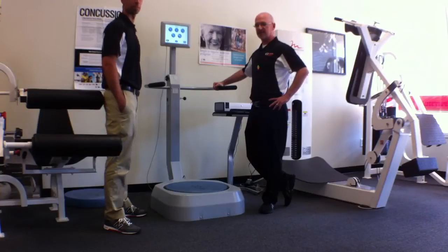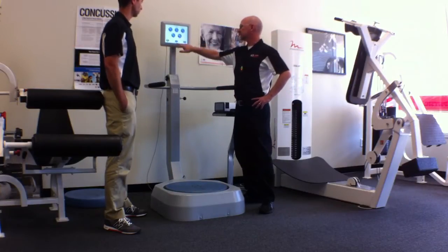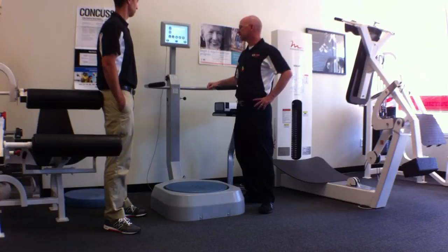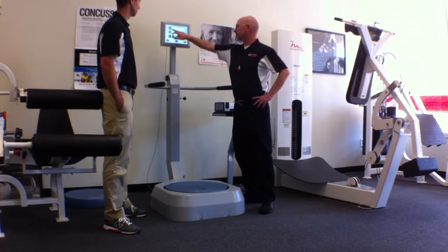Biodex has put together a test for us, but I want to make sure we're all on the same page for that. On the base screen, we're going to choose testing, and then fall risk is right up there. We can just hit fall risk. In this instance, we are going to pick the height of the person. What's your height? 73. So we're going to go ahead and put the person's name in.